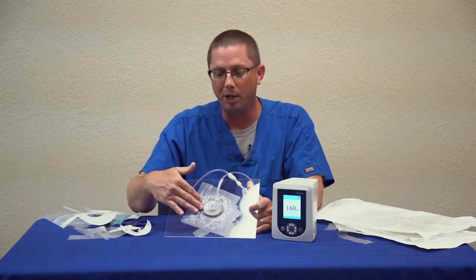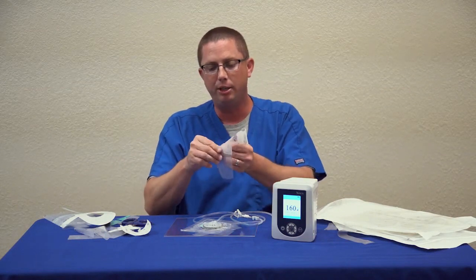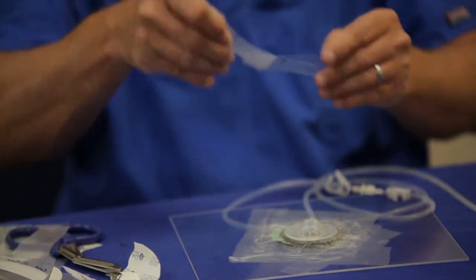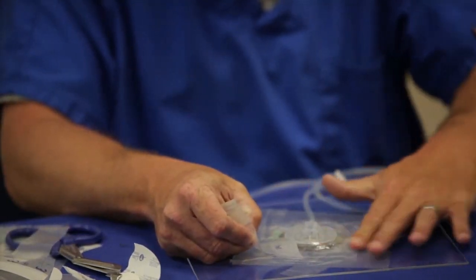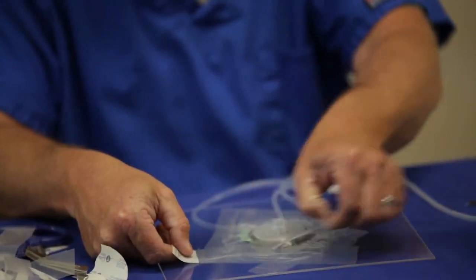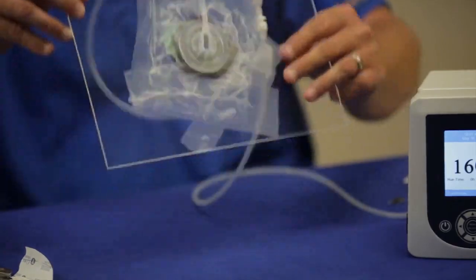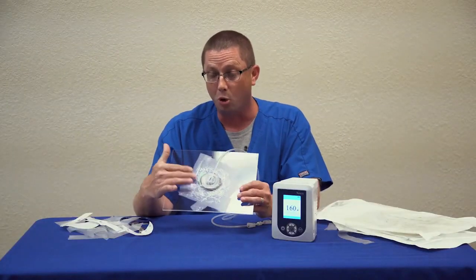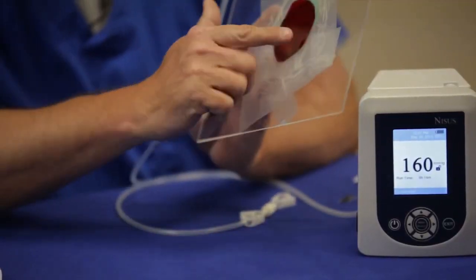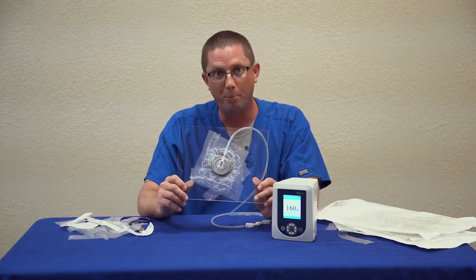If any of these air leaks are present, you can cut a little piece of drape where the air leak is, and you just apply that over the area of the dressing that experiences the leak. Again, the foam will look drawn down. It'll look raisin-like in appearance, and you can see it from the back side there too. It's completely compressed. This is your completed negative pressure wound therapy dressing application.